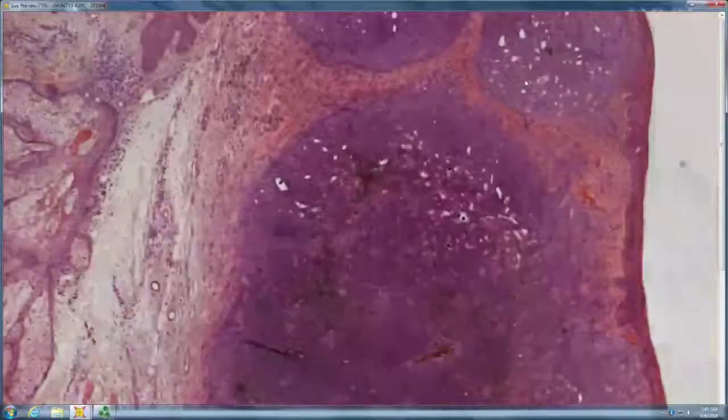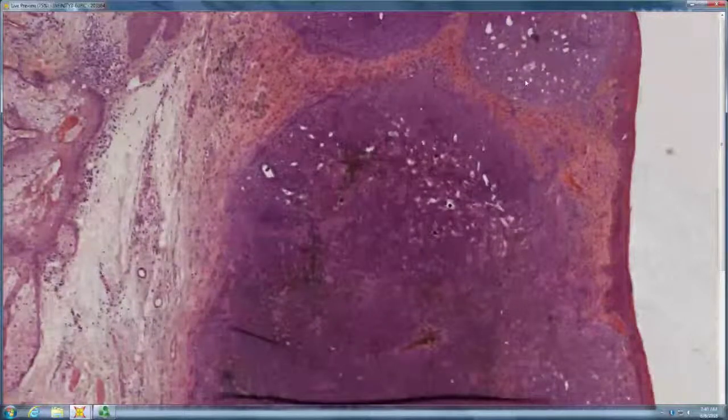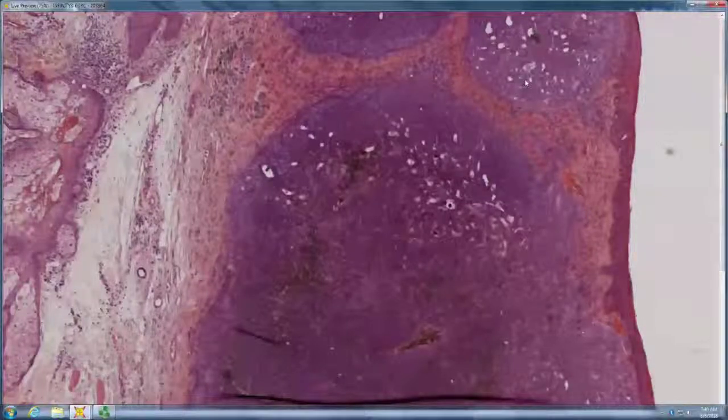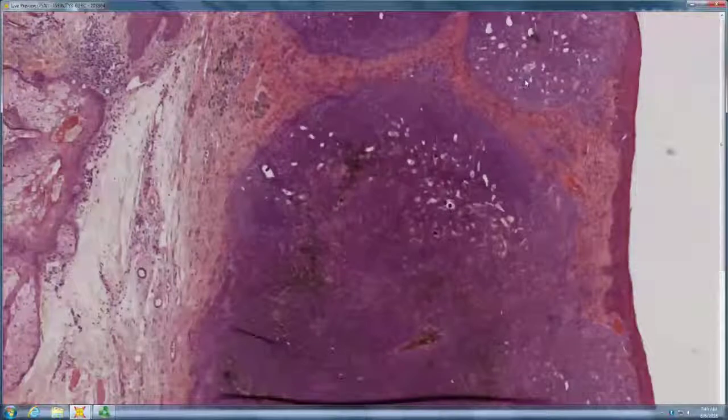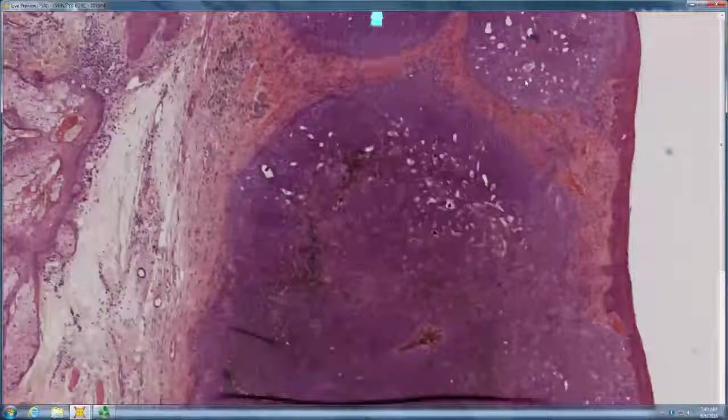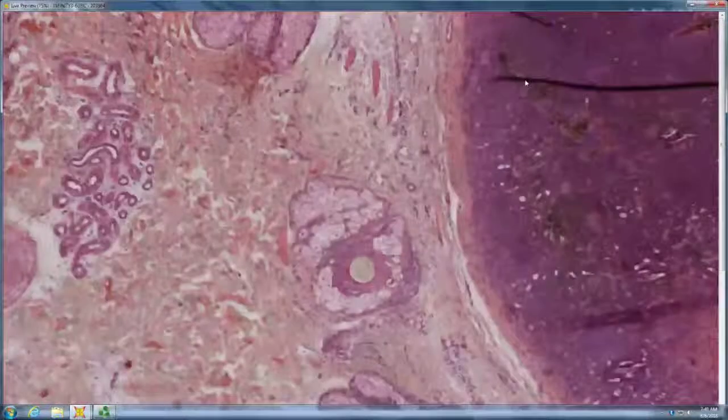Yeah, sort of Swiss cheese, but this one is a big enough ball. Some people would say trichoblastoma because it's just sort of a uniform big mass rather than being little fingers like trichoepithelioma. But as you pointed out, trichoepithelioma can have a Swiss cheese appearance, so-called cribriform appearance. So either way is fine, to call it trichoblastoma or trichoepithelioma, either one's fine.